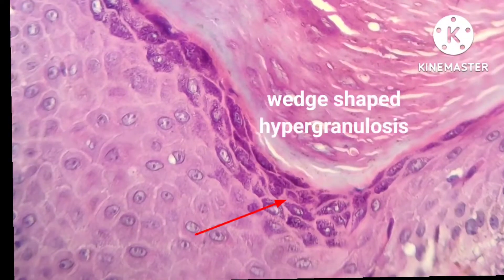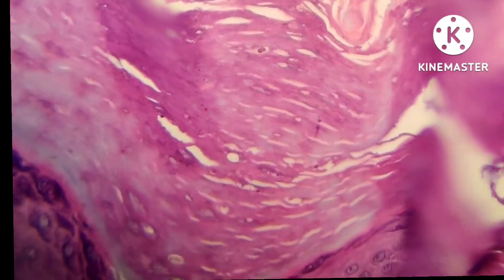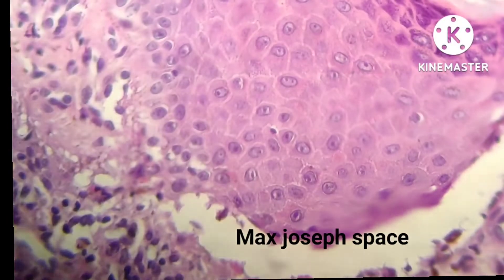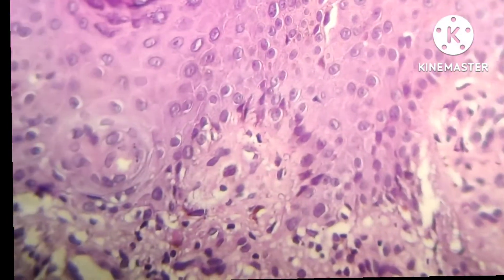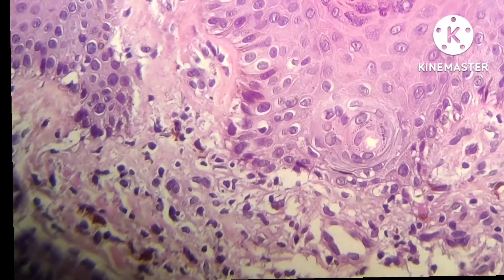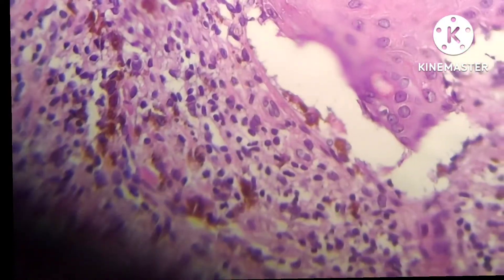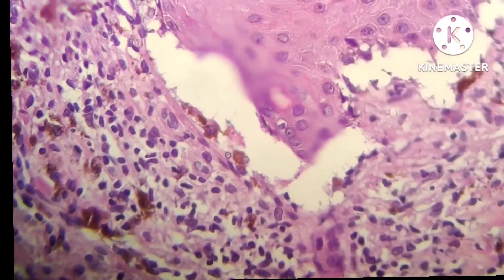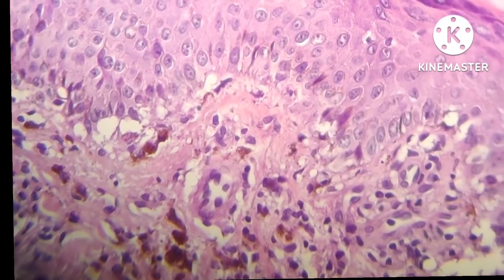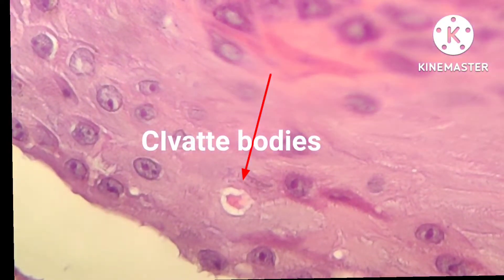Let us look at some more changes under higher power. This is wedge-shaped hypergranulosis and compact hyperkeratosis. See the Max-Joseph space. Inflammatory infiltrate in the upper dermis. Look at this civatte body.